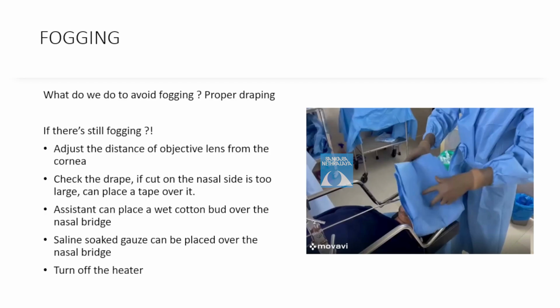Now this is, to me, a compromise because there is always a small chance that you can contaminate your hands because you're trying to stick the entire drape onto the eyeball around the eye, or you may end up sticking it so eccentrically, like what you did. Can you continue the video?